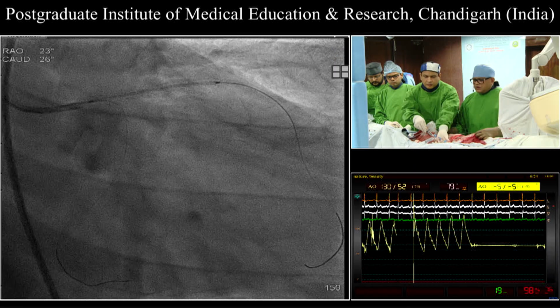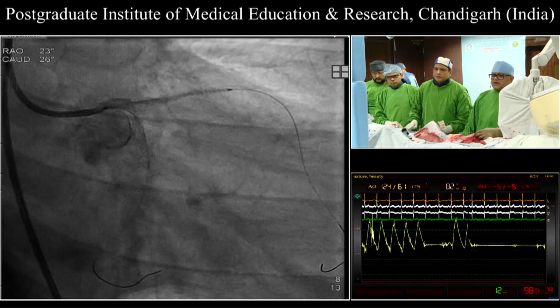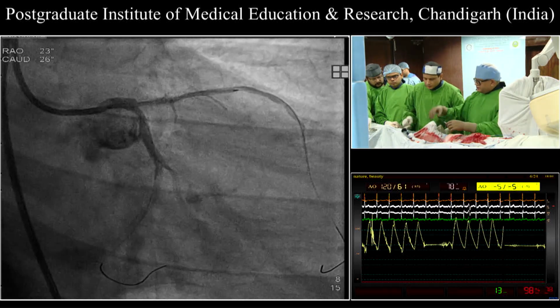So this is the positioning of the stent, distally covering the whole of the lesion. Let's go ahead.